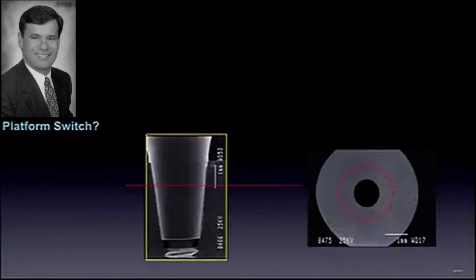I like it. But I also know that there are real limitations to that, and particularly in an anterior, high-end aesthetic situation, I'm not going to use that. I have to have something like this, and it allows me a unique opportunity. So this connection seems to be very significant. So I would argue that it is not platform switching at all. It's a completely different design, a completely different fit, and a completely different outcome.